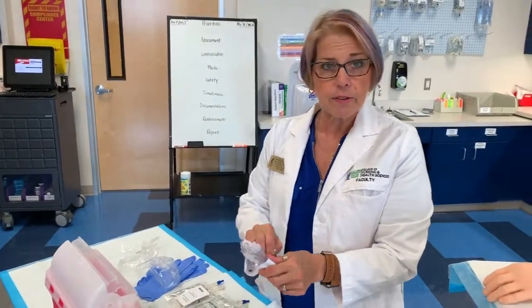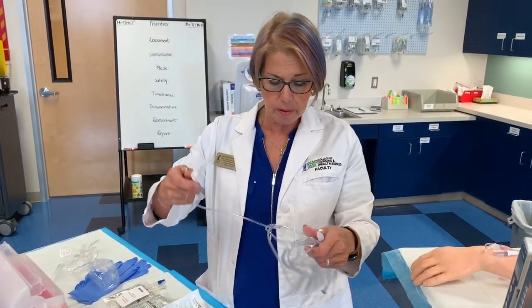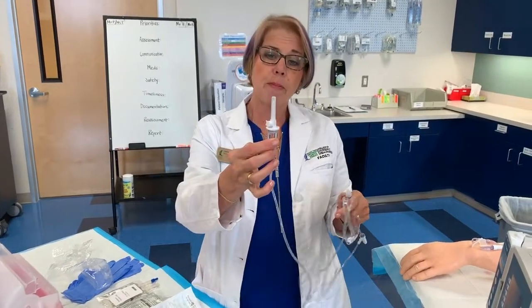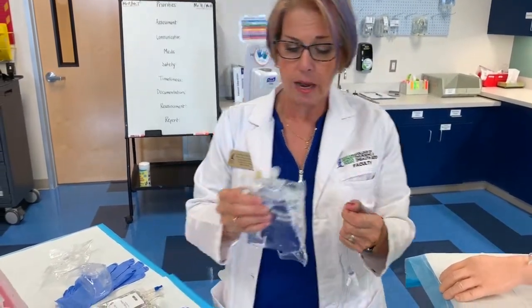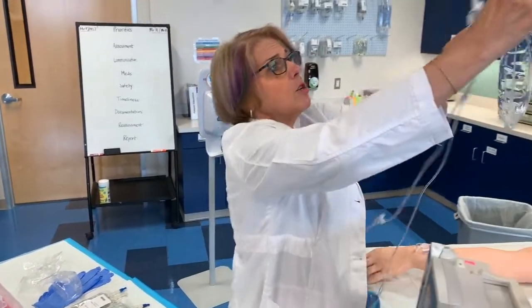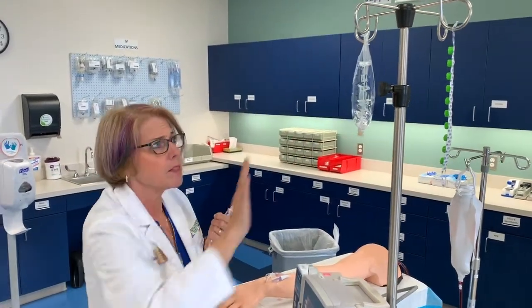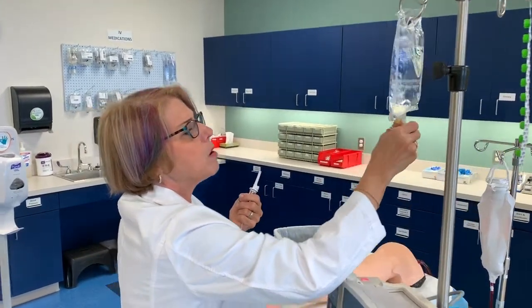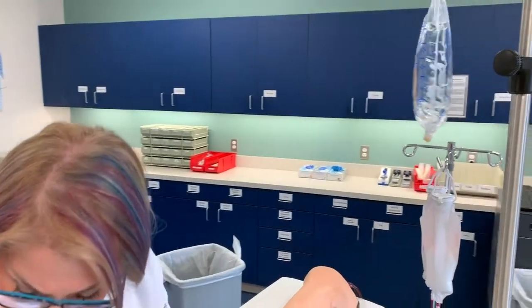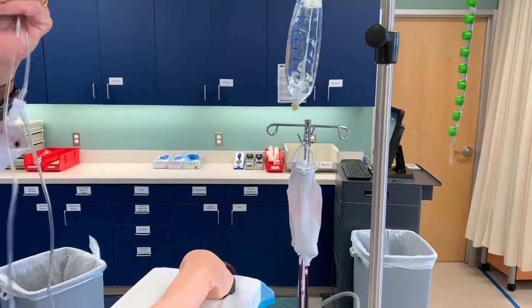Remember, when we start IV fluids, we want to make sure we're paying attention to sterile technique. So you'll see we have the top of our IV fluids and the bottom that connects to the patient. So the first thing is you want to take your IV fluids, and I often like to use my pump as an extra hand. So I can go ahead and hang that. I always like to hang the bag facing out so I can always see what is in there. We want to go ahead and remove the plastic tab, and you can see when I take that off, nothing happens. And then we're going to go to our tubing.